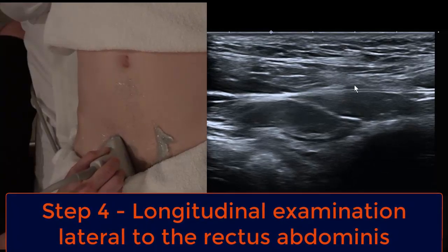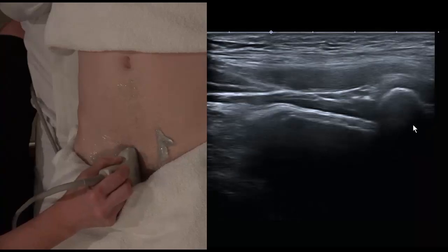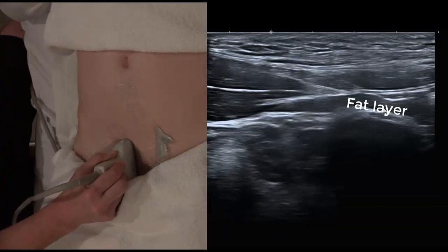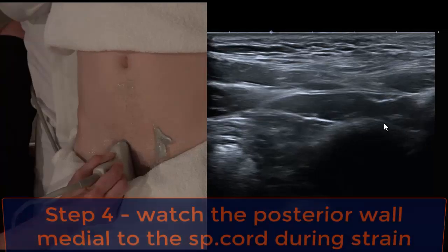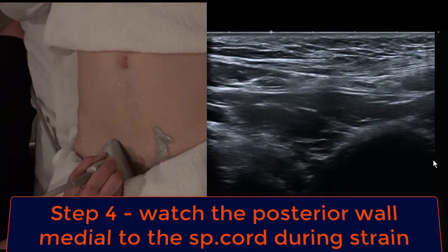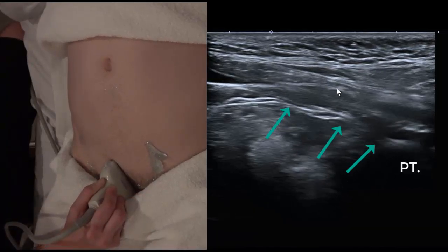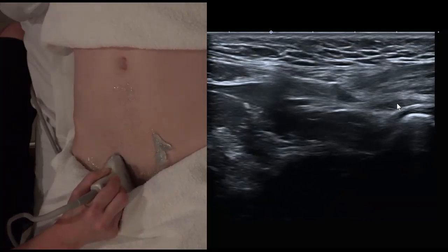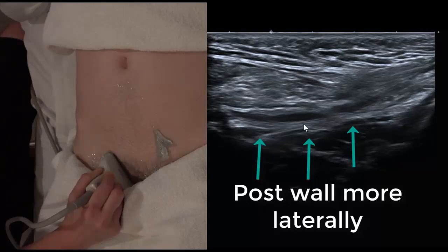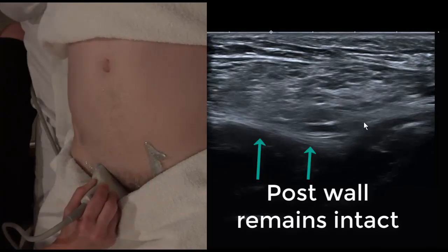In this location we see peritoneum, and we can see behind the rectus abdominis our peritoneum and transversalis fascia. Turning back into longitudinal, once we identify that layer we move the probe laterally — rectus abdominis disappears, we see conjoint tendon over the top, and we ask the patient to strain. Naturally we're seeing peritoneal bulge and the conjoint tendon sometimes bows up towards the probe, but that in itself is not a hernia. Any more laterally and we land back onto our inguinal canal posterior wall, which we check for a hernia that can mushroom up through that floor.